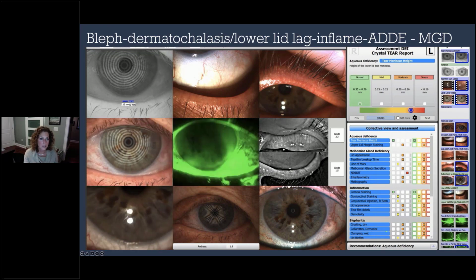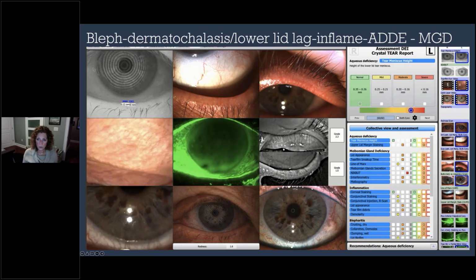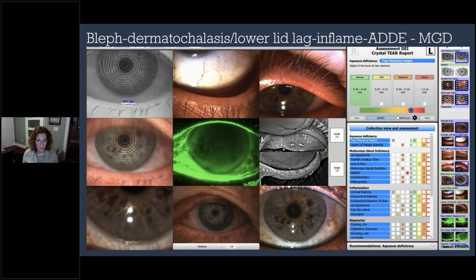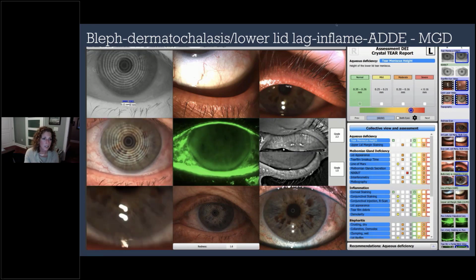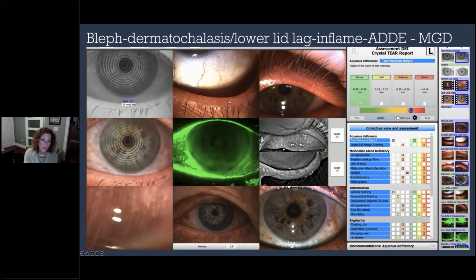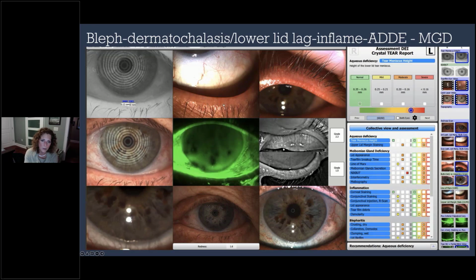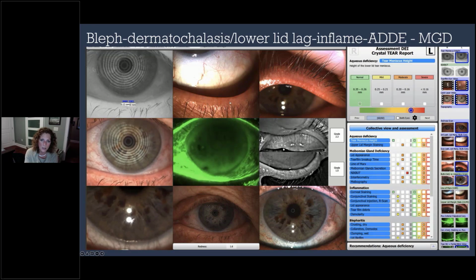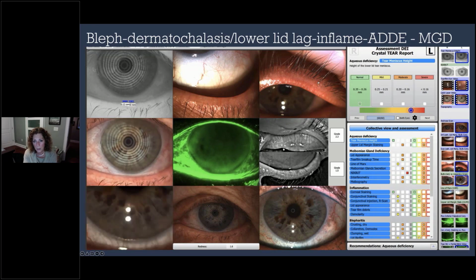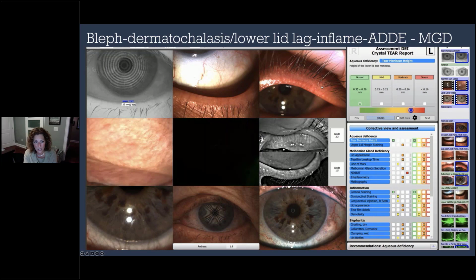So in this scenario, I told you we were going to find out, is there enough water, oil, allergy, inflammation, bacteria, lid function. So when we look at this, you're definitely low on water. When I look at your lid margin, I can see this vascularization there. We've got a little bit of rosacea along the lid margin, and you can see it really well on the top lid, but more importantly, maybe there's a lot of bacteria here at the base of the lashes.